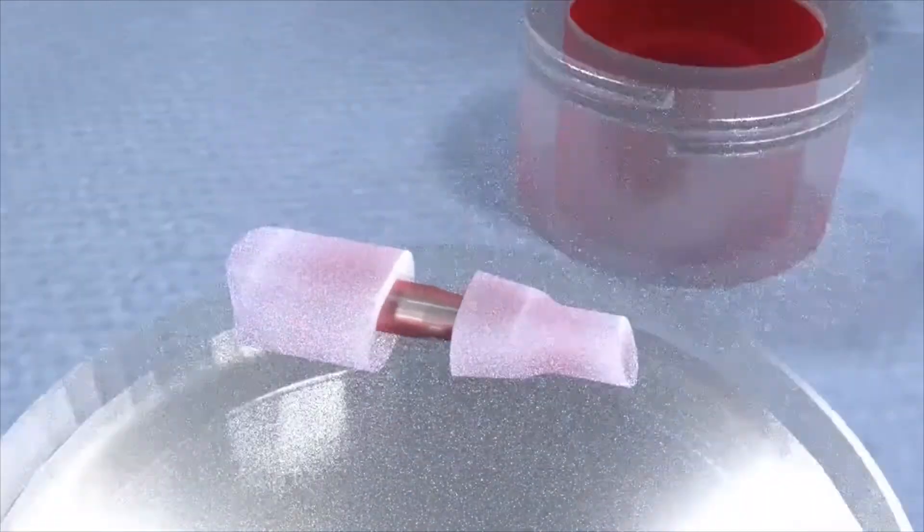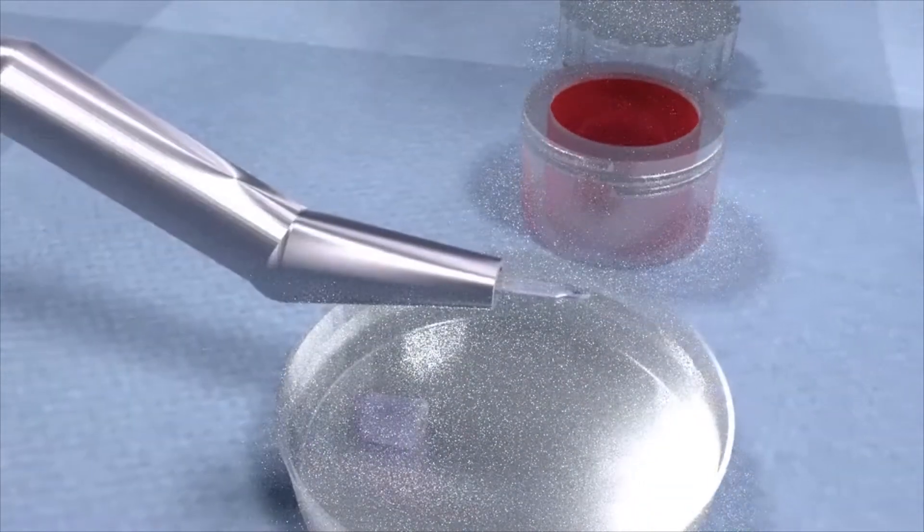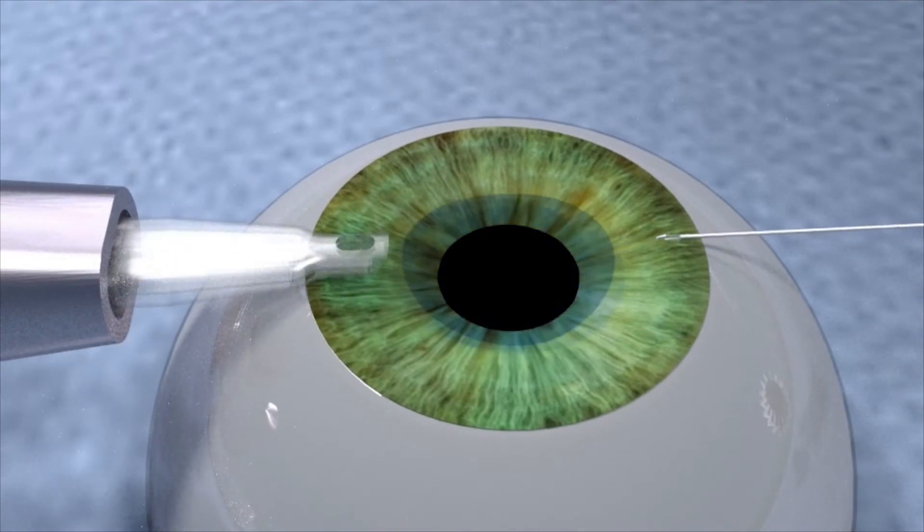In the operating room, the surgeon need only remove the caps on the inserter, attach the ergonomic handle, pull out the graft, and allow it to naturally unroll in the eye.